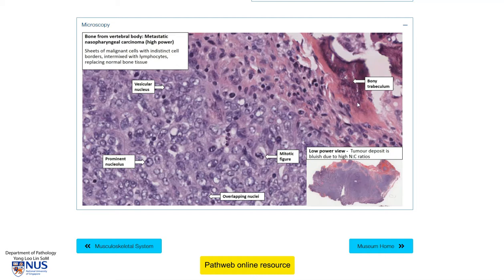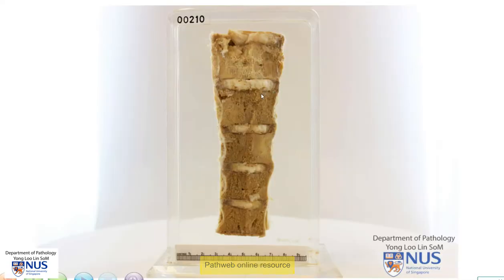Here we can see some of the bony trabeculae in the residual bone. In this patient, you can imagine that he may present with backache or even potentially compression fractures, so there may be pathological fractures on minimal trauma.